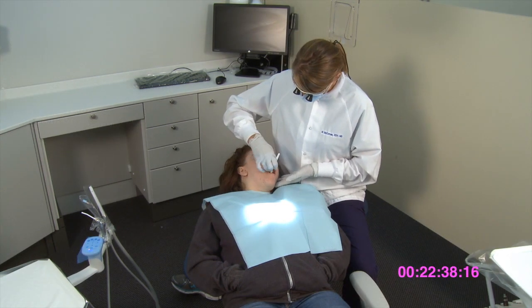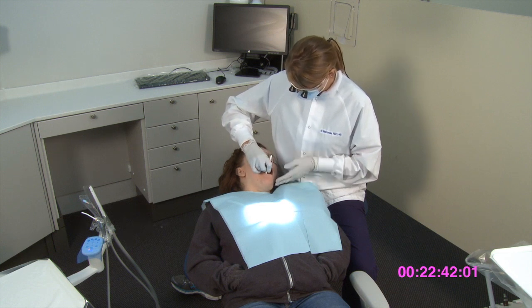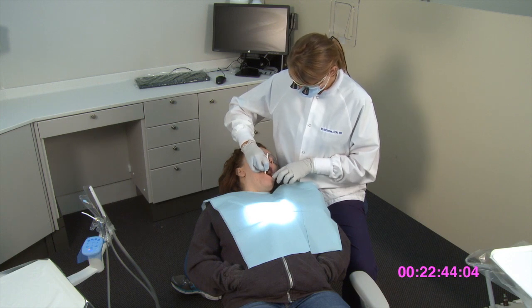It is important, as dentists and dental hygienists, that we constantly reevaluate our patient positioning and our own personal ergonomics so that we may practice for a lifetime.